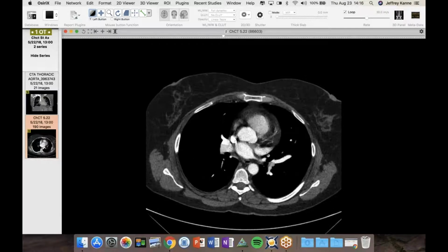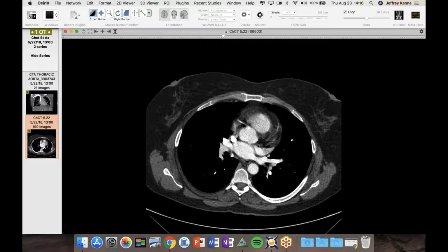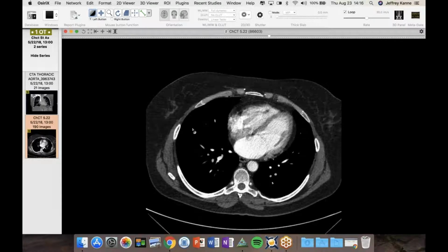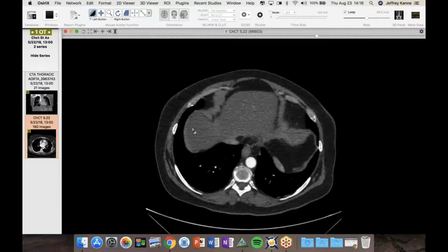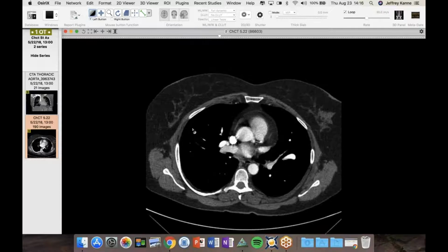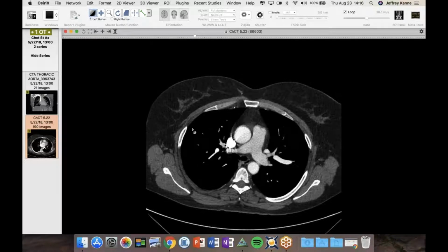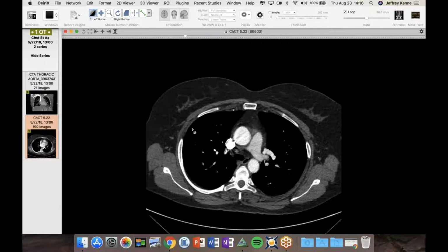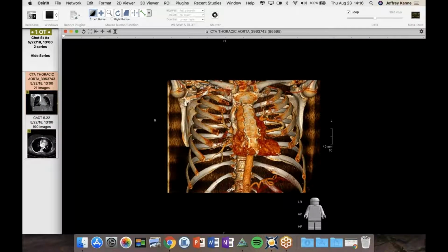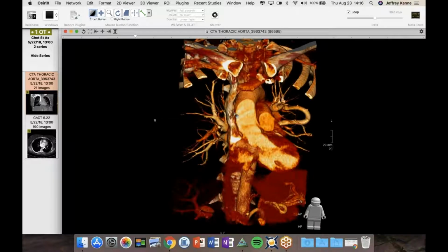Cool. And I've seen that in about half. What'd you say, Travis? I was going to say, a few years ago, Sushil showed a case of a patient that had AFib ablation and had a stenosis of one of their veins, and then on a subsequent study had developed a meandering pulmonary vein. Oh, really? I agree. It's some sort of occlusion, whether it be developmental or, in his case, they weren't this large, but they were clearly meandering veins that had developed after the post-op occlusion.